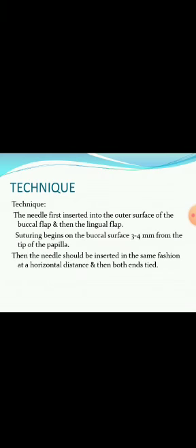Now the technique is that the needle is first inserted into the outer surface of the buccal flap and then the lingual flap. Suturing begins on the buccal surface 3 to 4 mm from the tip of the papilla. The needle should be inserted in the same fashion at the horizontal distance and then both the ends are tied.